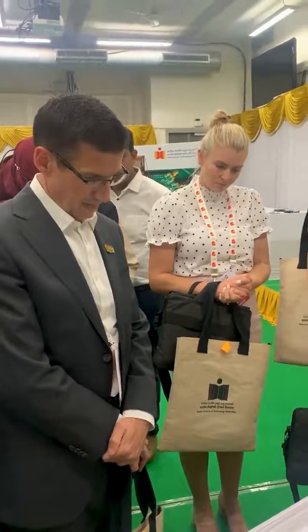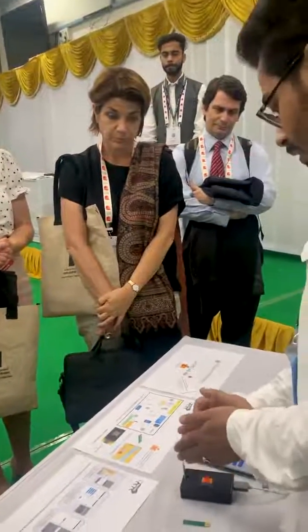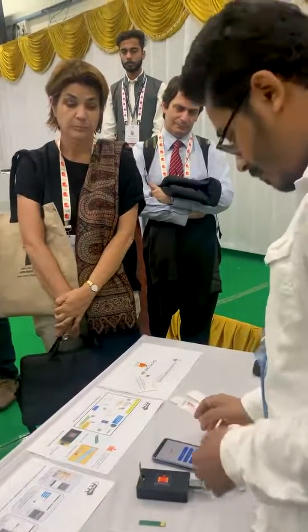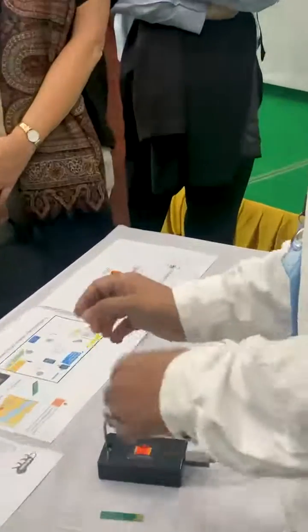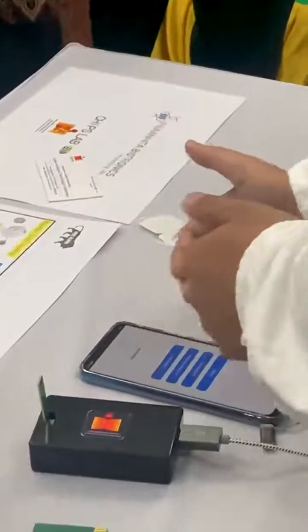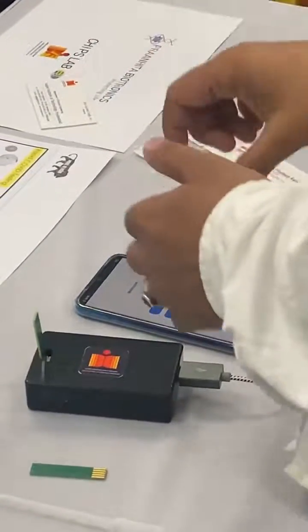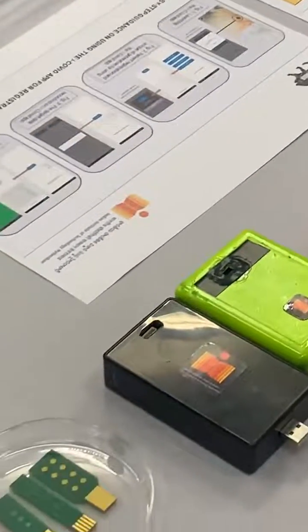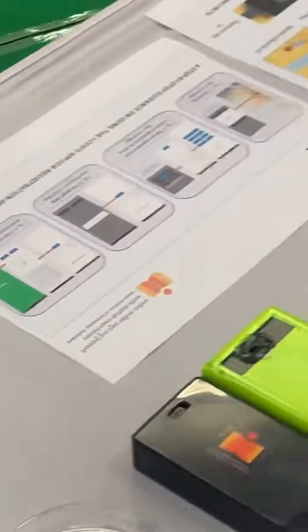So already we have enrolled the unique ID for this device, and with that unique ID we will show the test results. So here is the registration process. We can go for the registration, and the app will ask for personal information like DOB and all other things. We can enter that and a unique ID gets created, and then we can go for the preload of the sample. This is needed for the testing setup, and then we can go for the test of the sample.